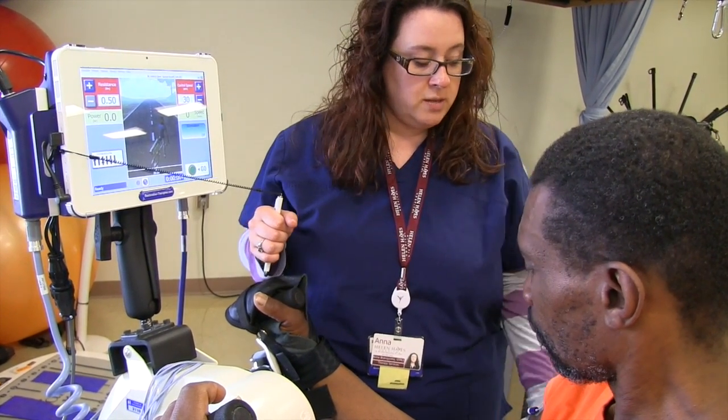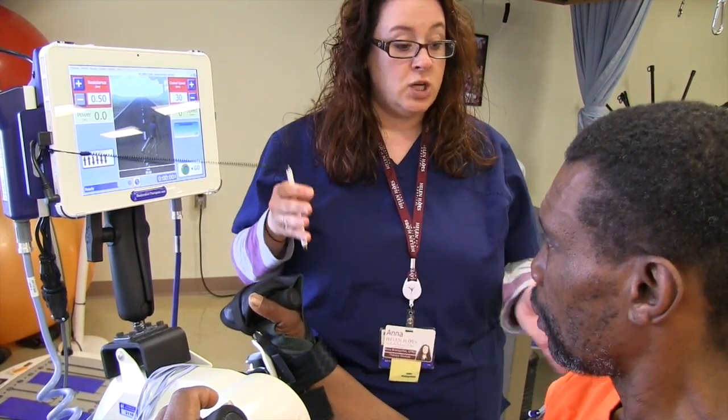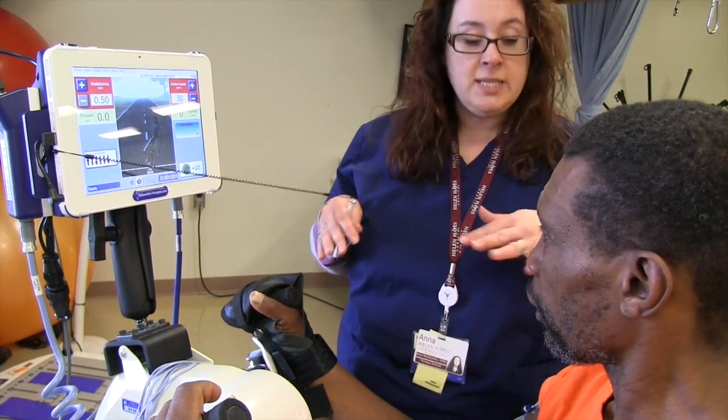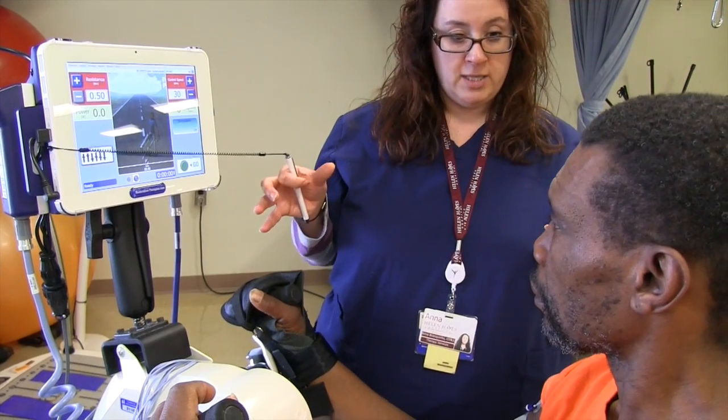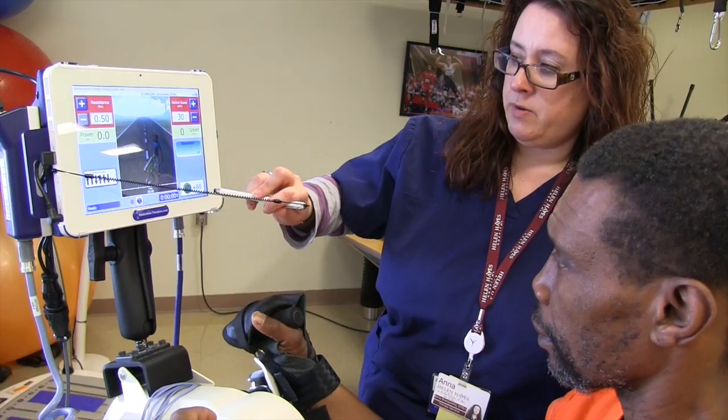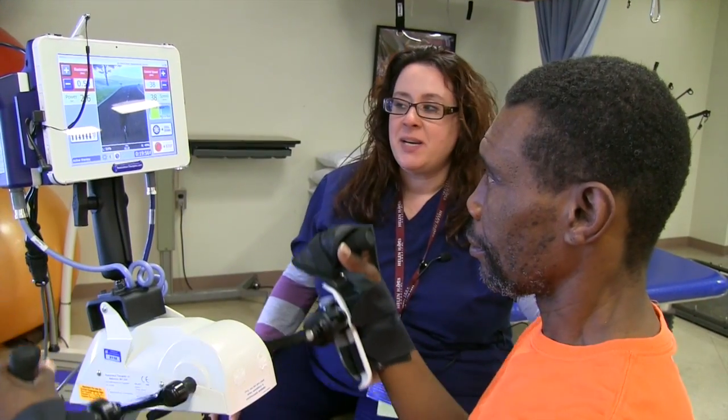The ones on the arm, which is this one in the back here, kind of cycle. The ones on top, right over your shoulder and in the shoulder blade, stay on the whole time to keep your shoulder nice and stable and in good form. So you ready? Yes. All right, I'm going to hit go. This is the FES bike.